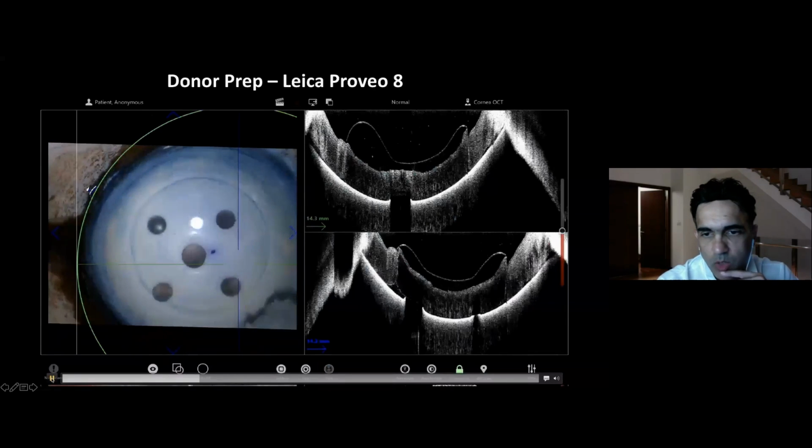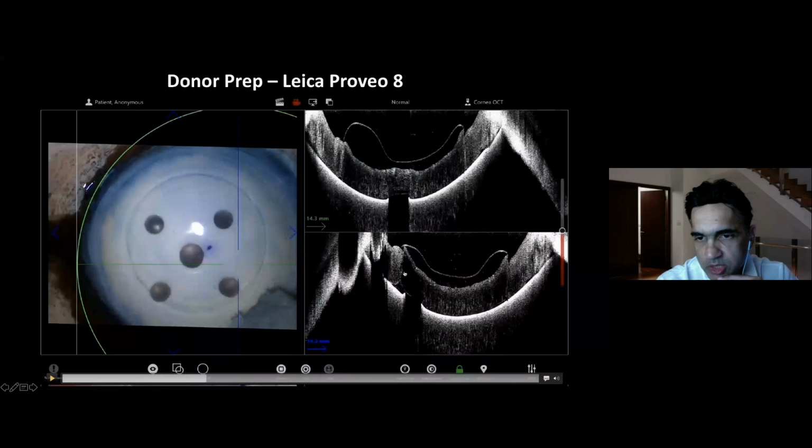Okay, so what we're going to do is I'm reducing the fluid. And what you can see here is the fluid line above the DMEK tissue. Now, I can tell you when I do this clinically, I just know from experience how much fluid to be there. And if you ask me how do you measure it, I can tell you honestly, I have no idea. I just put enough drops on that I feel the graft will not scroll.